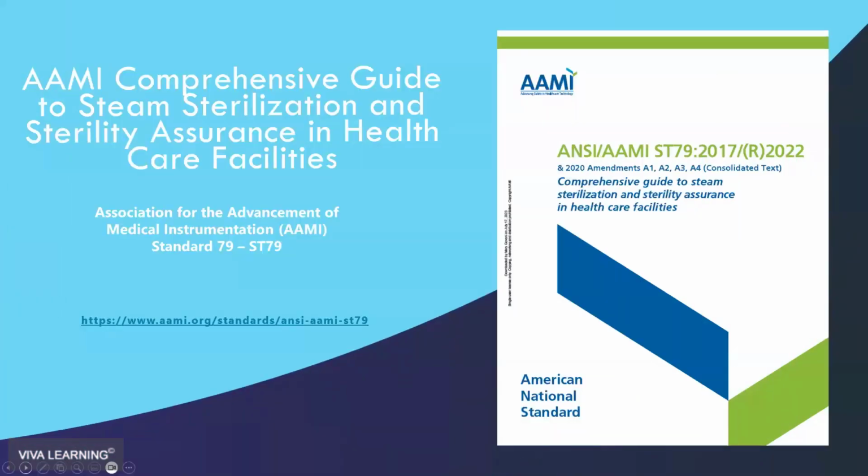Now, I've been sort of alluding to a group called AAMI. And AAMI stands for Association for the Advancement of Medical Instrumentation. And they have a number of standards. The one that's the most important to us in this context is Standard 79 about sterility assurance, and it applies to all healthcare facilities.